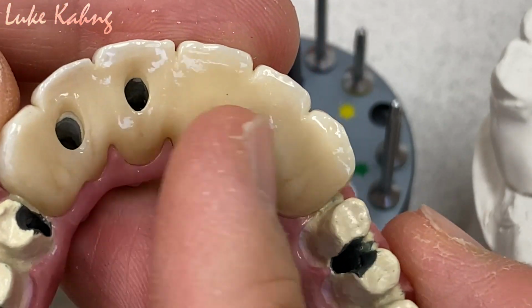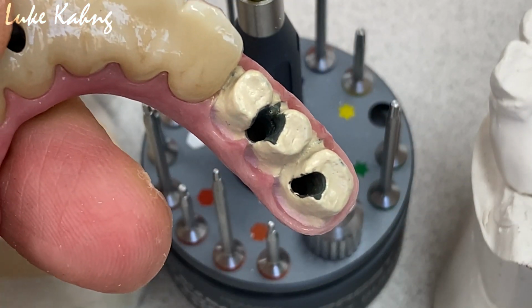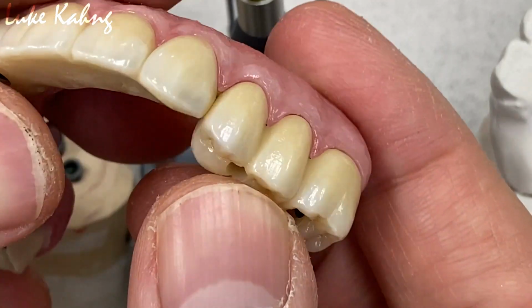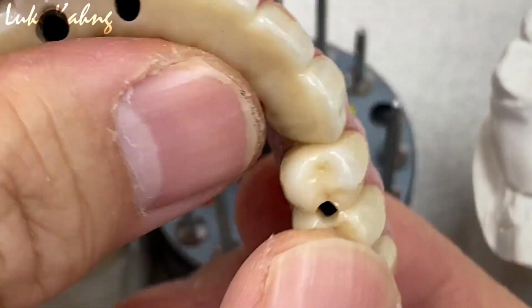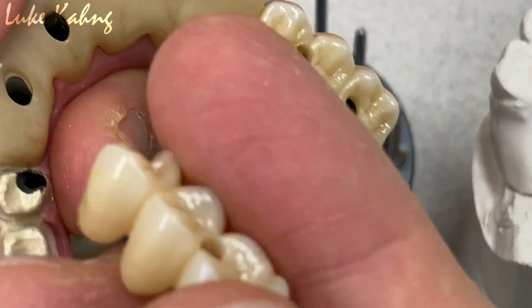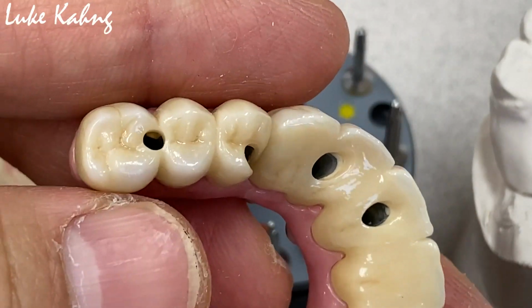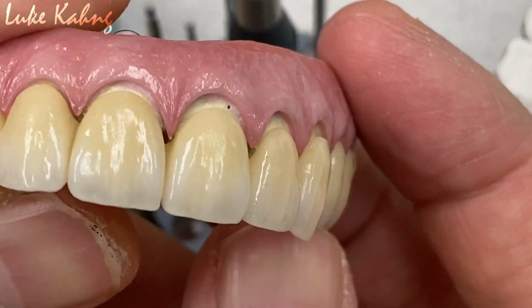Here's the occlusion, so full protection with zirconia, and then due to the implant site, we made the 3 unit monolithic. This one is finishing. Yes. That was the final restorations.